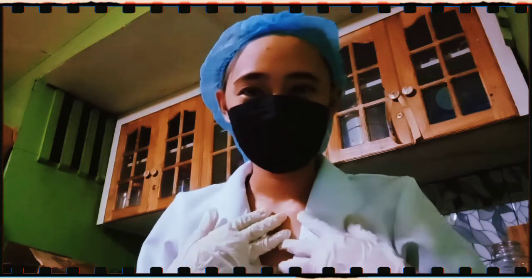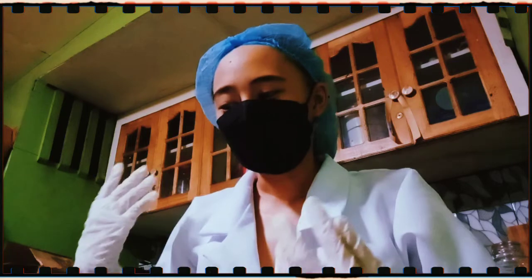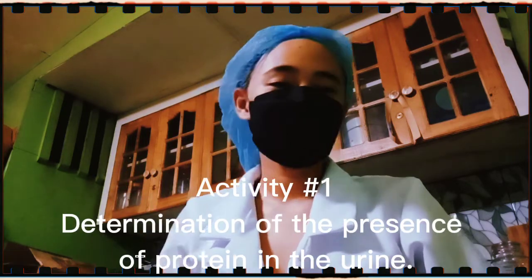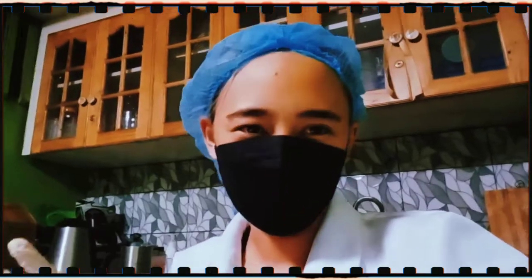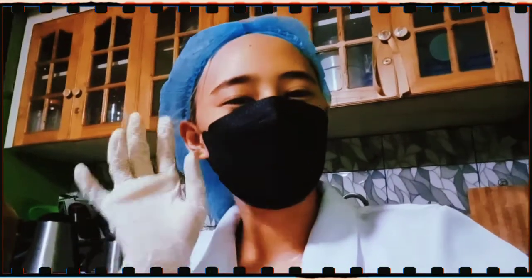So this is Mariel Claire Aberones. I'm from BSN 1823. So today I will be conducting an experiment on determination of the presence of protein in the urine. Before anything else, let's first tackle the objectives of this experimentation.